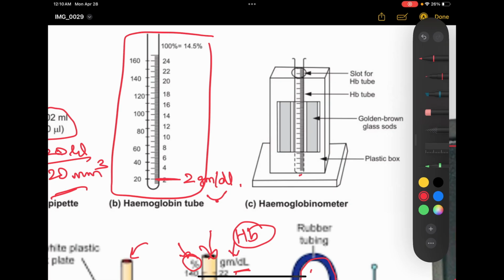Now why is it done? Because if you are doing it the other way around or just rubbing it, the dirt is going to stick to one area, or it will come from the periphery and remain in the center. Since it's one finger, you can make one wipe, but if you are making a finger prick in other areas, you are supposed to always move your gauze piece or cotton piece from the center to the periphery.